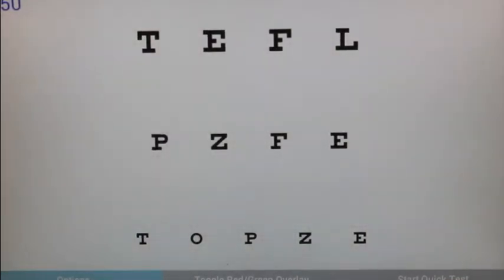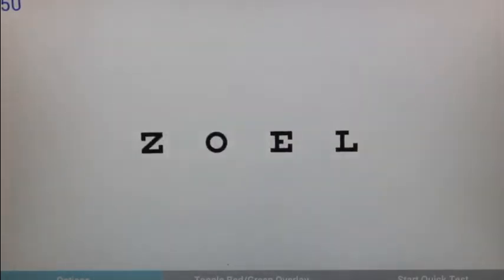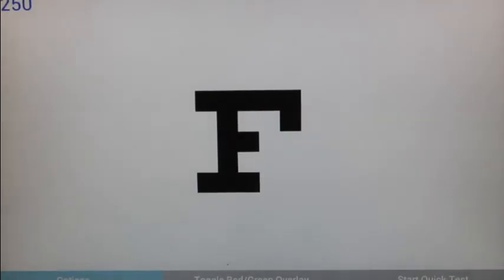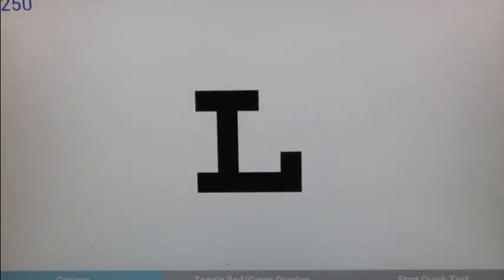We can then turn the control panel over and we can press R, which will randomize these, and we can press L, that will give us a single line Snellen, not multiple lines, and it will have the correct label in the upper left hand corner for each. If we press L again, it gives us back our multiple lines.